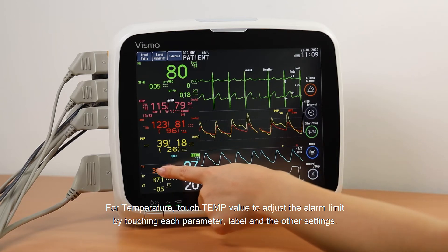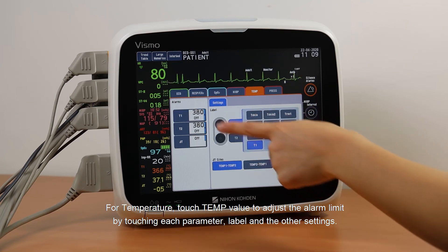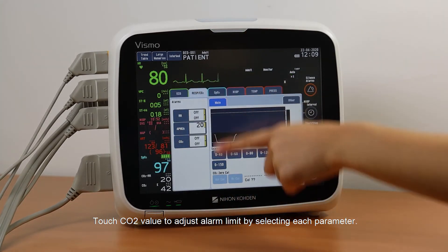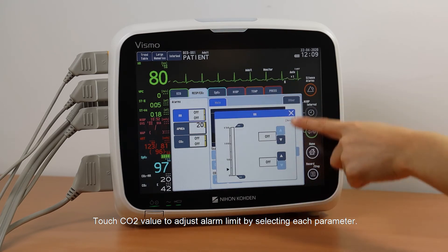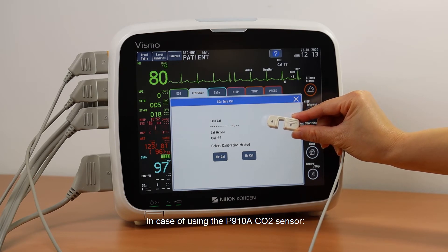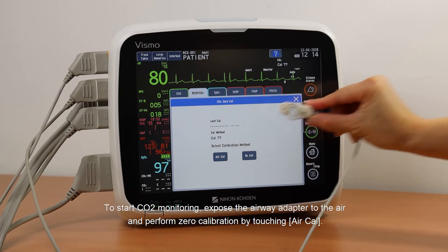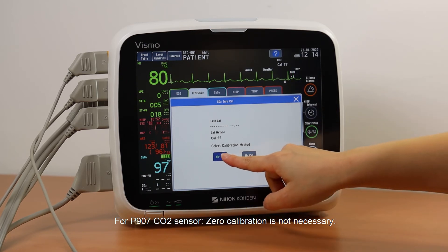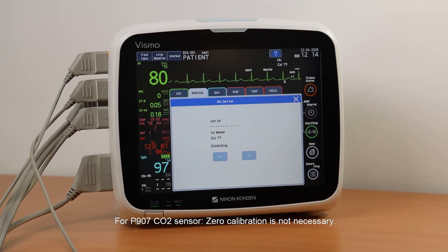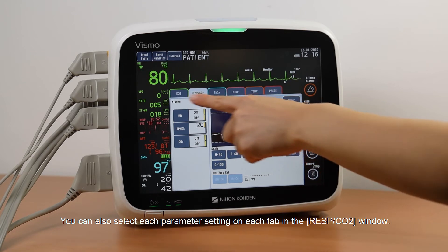For temperature, touch the Temp value to adjust the alarm limit by touching each parameter, label, and other settings. Touch the CO2 value to adjust the alarm limit by selecting each parameter. In case of using the P910A CO2 sensor, to start CO2 monitoring, expose the airway adapter to the air and perform zero calibration by touching Air Cal. For the P907 CO2 sensor, zero calibration is not necessary. You can also select each parameter setting on each tab in the REST CO2 window.